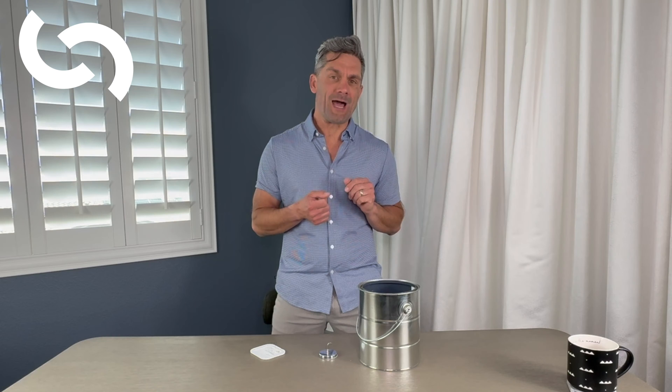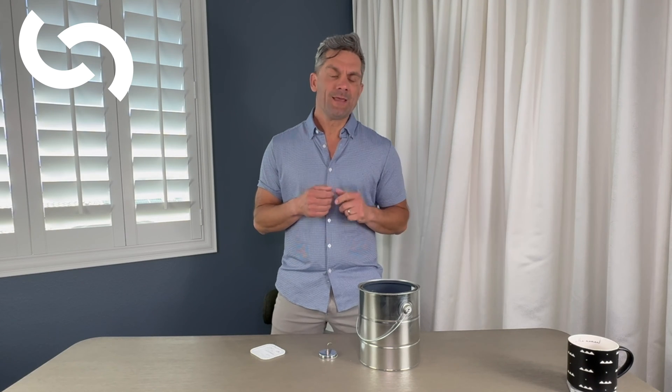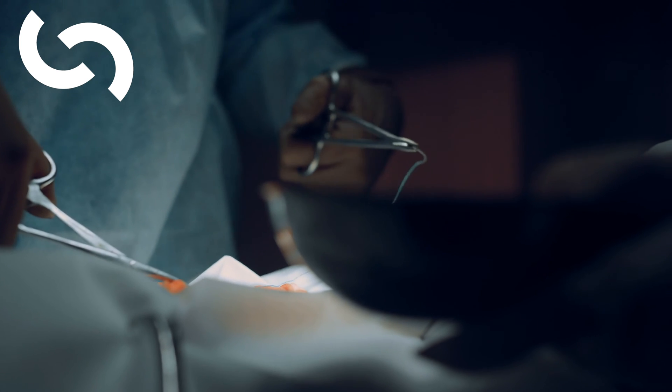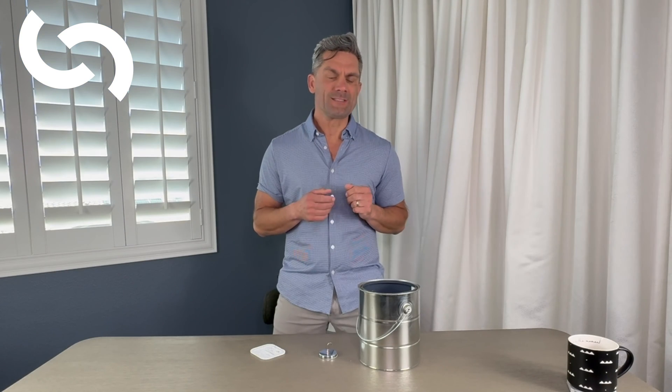I'm going to take you through today a simple setup for tying deep knots. When do we need to tie deep knots? Imagine we're in a deep cavity in the abdomen, or we're in the chest tying through an opening for a chest retractor, or we're deep in the pelvis. Perhaps there's bleeding on the sacral wall and we're putting a figure eight suture in and tying down to stop that bleeding. We've got to be able to tie down into tight spaces.